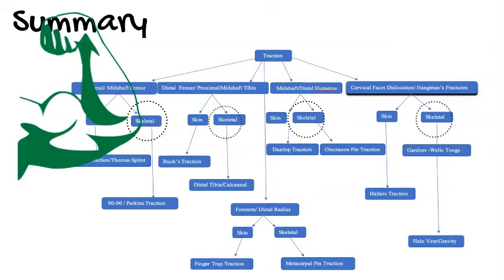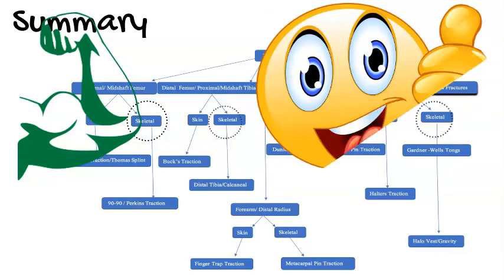Okay, I need to elaborate more in a later video or in another video. For skeletal traction, the Gardner-Wells tong can be used as a temporary or permanent method of traction and later can be changed to a halo vest. Or once the fracture is united, we can use a collar as an additional stabilization.